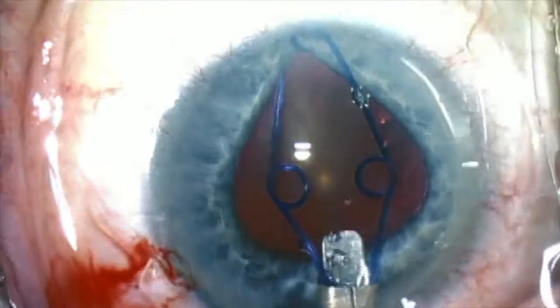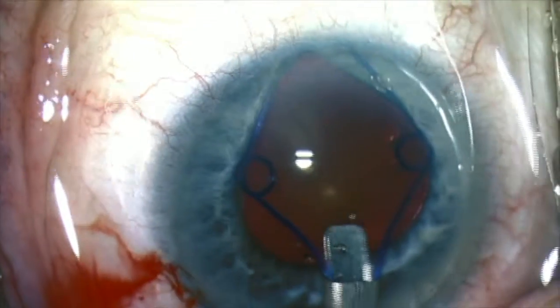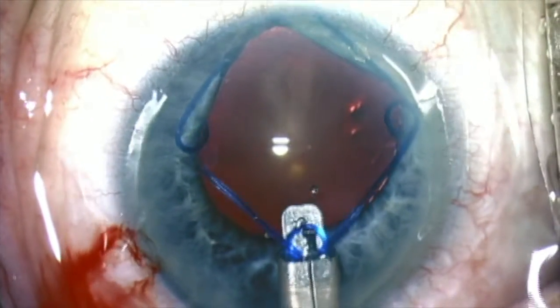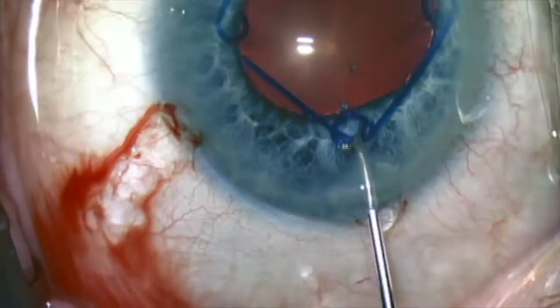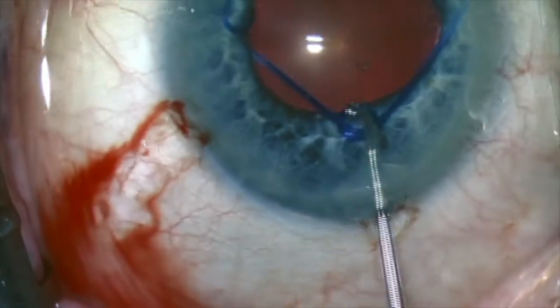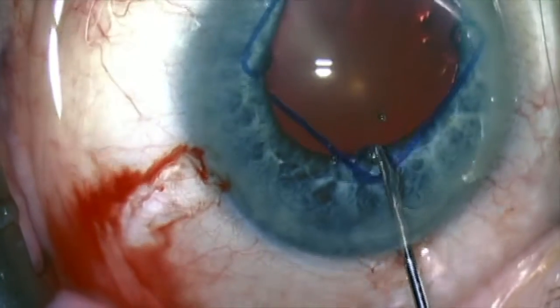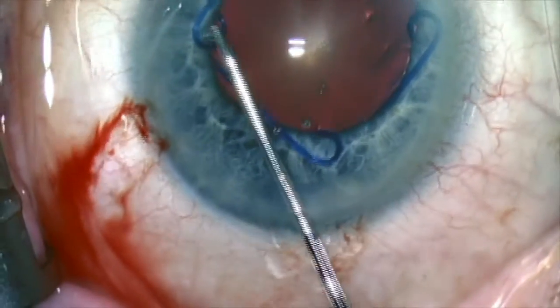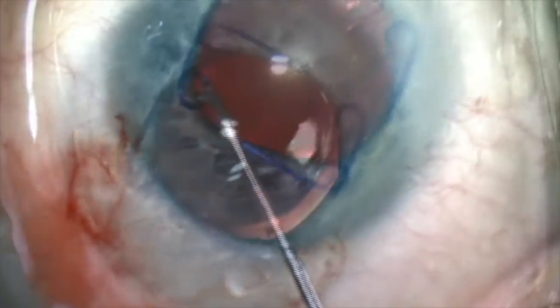I place OVD at exactly the three positions where the scrolls or the eyelets of the Malyugan ring are going to engage the pupillary edge. Then I come out and go in with the Malyugan ring manipulator to tuck in the proximal scroll right at the site of the incision.